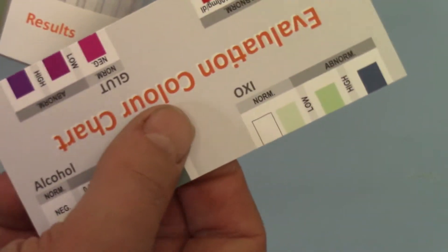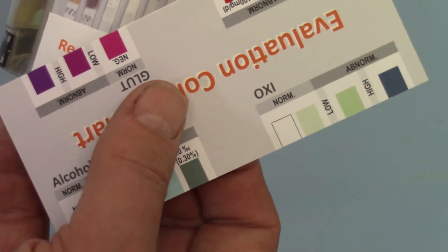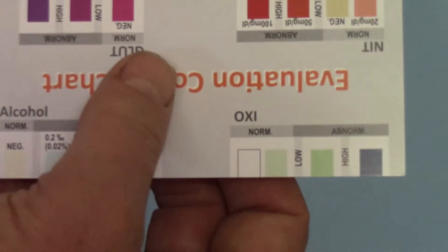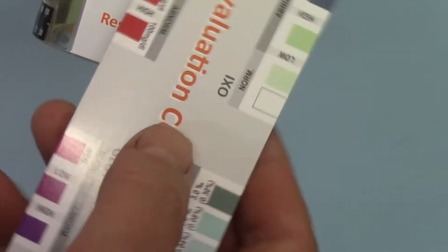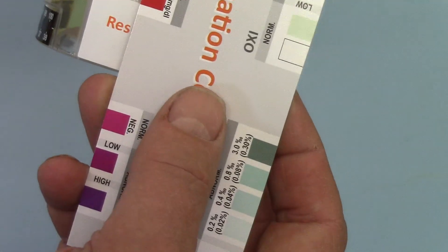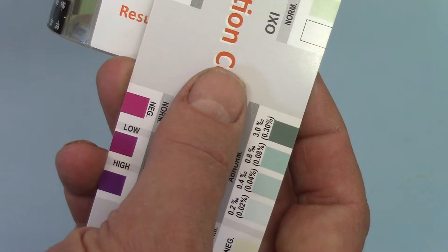So we're looking for the comparison level on the pads and coding. For nitrite, you compare against the top thing which is negative, that's normal.